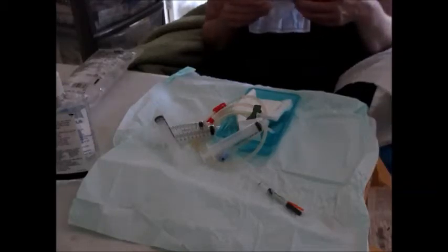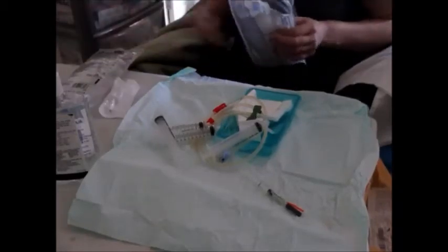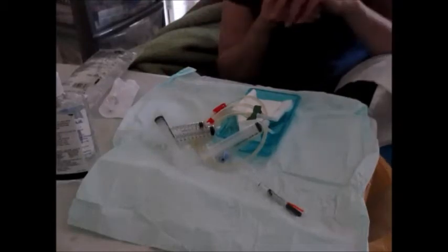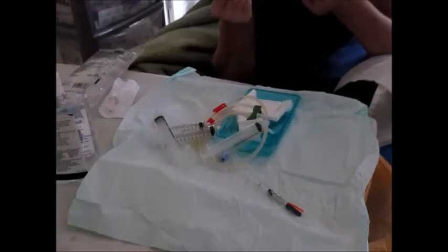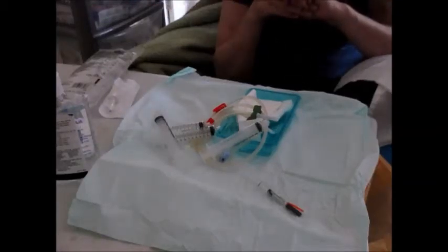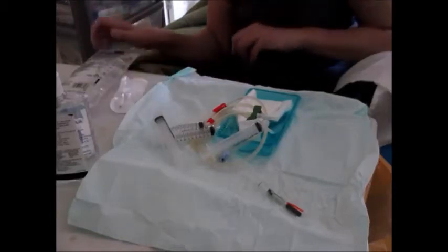If you're not able to wash back the saline that comes through online, personally — if I'm on my own and there's a need for an emergency washback at the end by manual means — I would rather lose the circuit at the end than risk standing up alone to wash back the blood. To me, standing up on your own before you've checked your blood pressure and how you're feeling is more of a risk than losing the circuit. That's my tip.